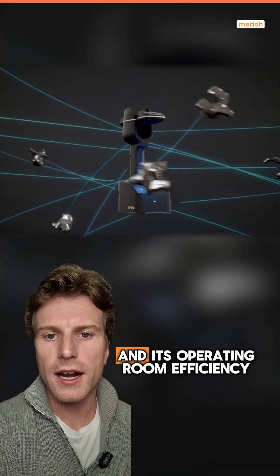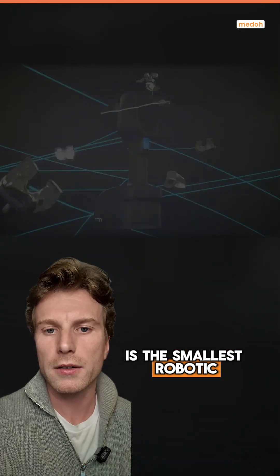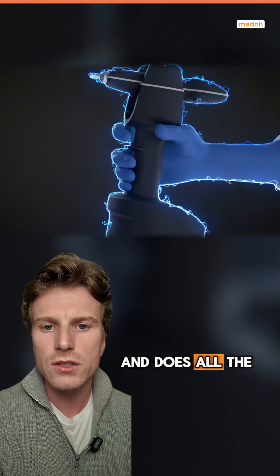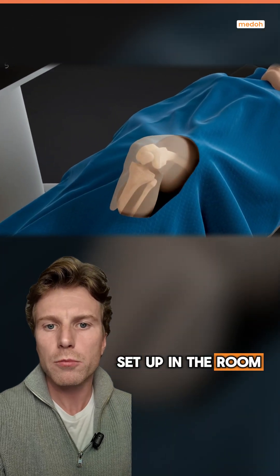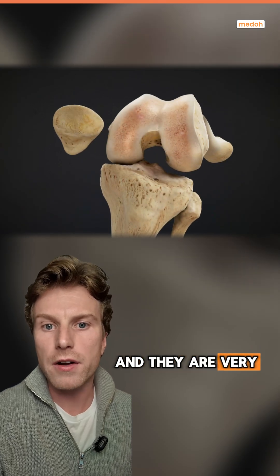The first is its size and operating room efficiency. The T-Mini is the smallest robotic knee replacement on the market. It's handheld, but has all of the same technologies and software embedded into it and does all the same things a bigger robotic knee replacement does. Because it's so much smaller, you don't need a big robotic arm to set up in the room, which is huge because operating rooms are usually very small and very cluttered.